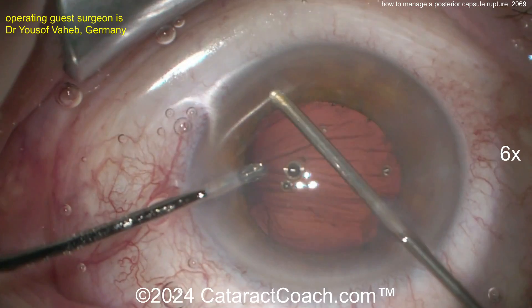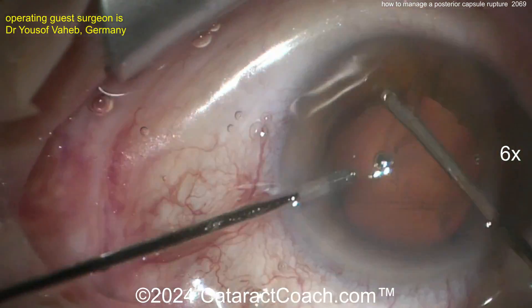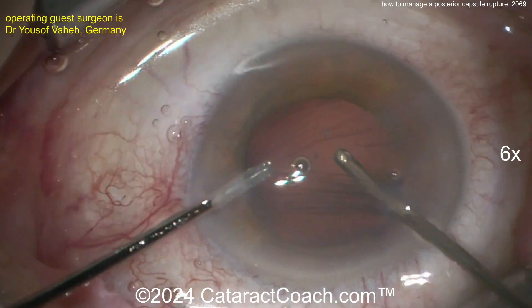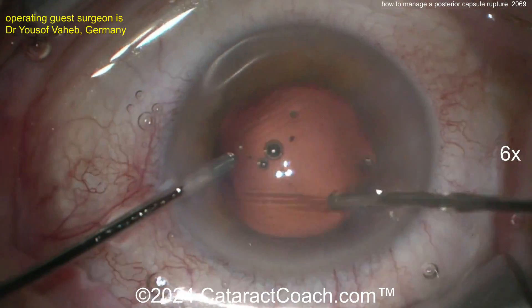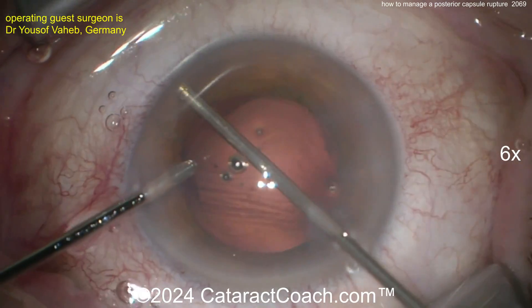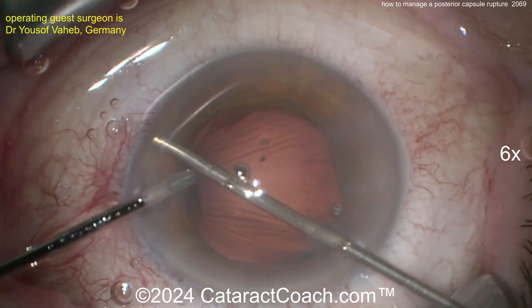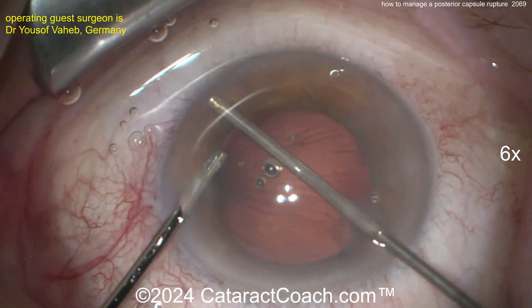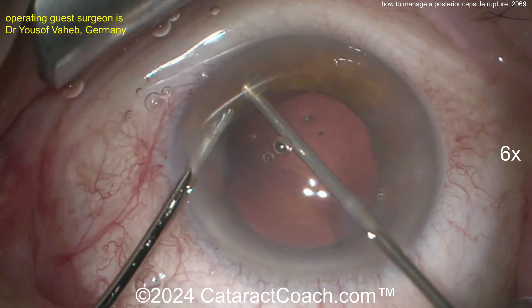Make sure you understand the difference in the vitrectomy settings. You may also need to augment the anesthesia — give the patient more anesthesia both systemically and locally. You don't want to do a whole vitrectomy on topical-only anesthesia; that may not be enough, and this procedure is going to run longer. We've sped this up — the vitrectomy here is at 6x speed.